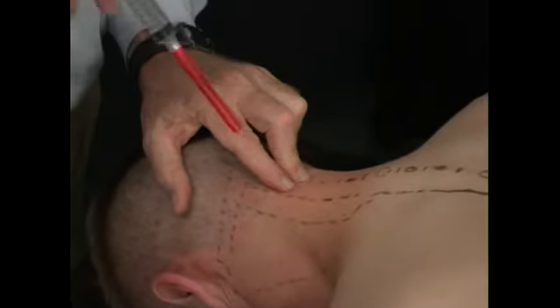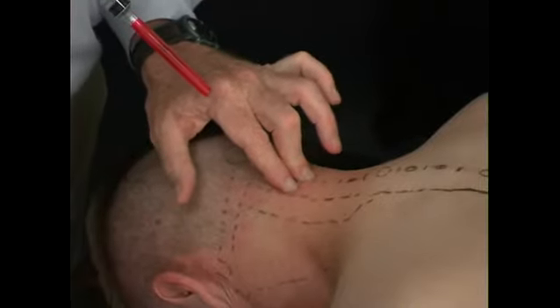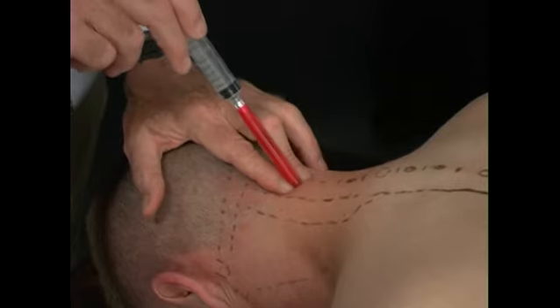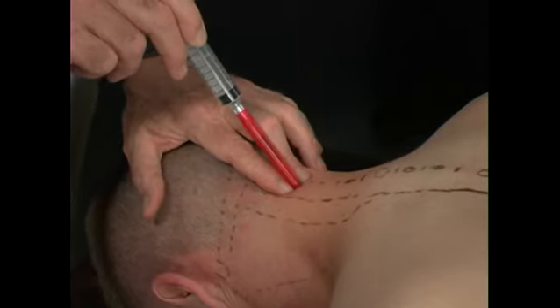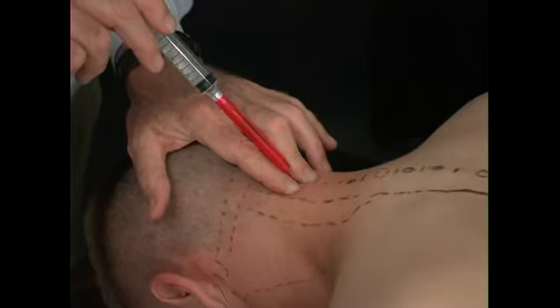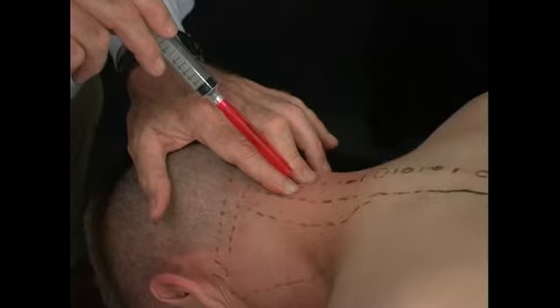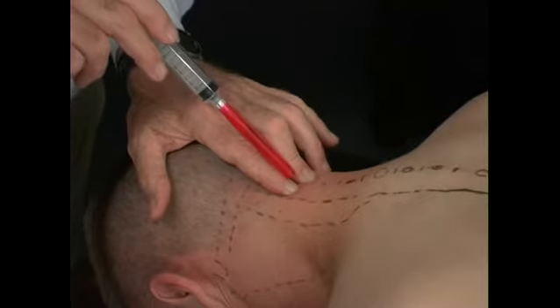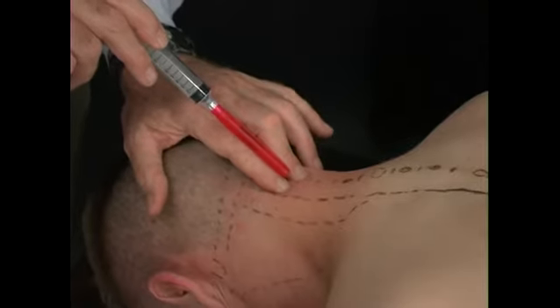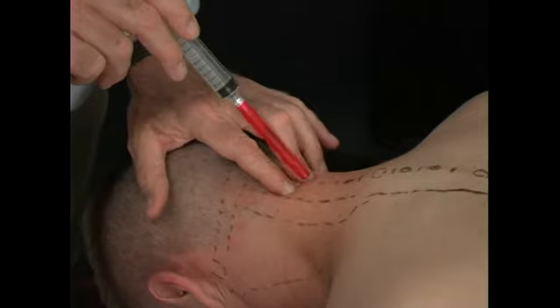prominently here. And again, with my fingers locked over that spinous process, so I can feel it right between my fingers, I come in directly onto the spinous process with the needle. I can then come back out to the skin level, which is an important concept. If you do not come out to the skin level with the needle, not out of the skin, but just below the skin, so the needle is just subdermally, you will be in the fascia and your needle will simply bend and go down in the same track.